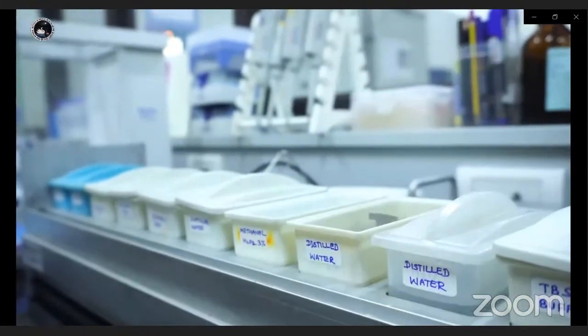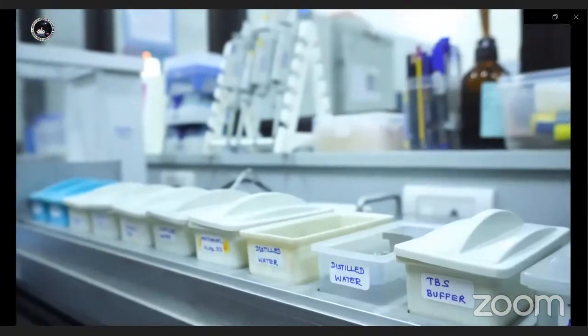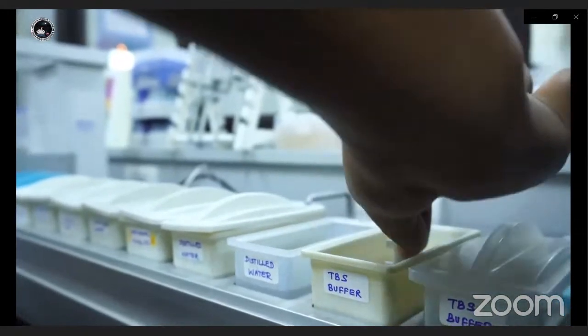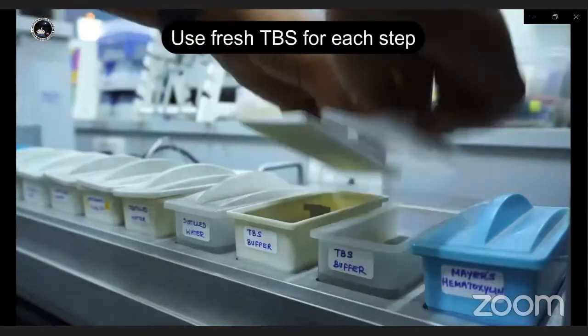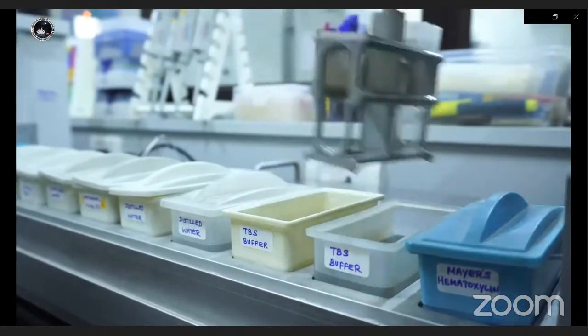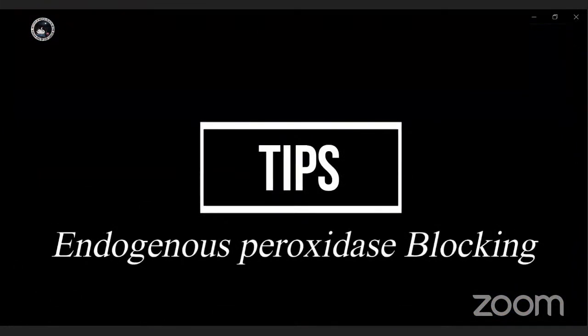Wash the slides in distilled water for 5 minutes and in TBS for 5 minutes. Remember to use fresh Tris buffer every time. This step of endogenous peroxidase block is very important. Make sure methanol H2O2 is freshly prepared for each use. If not, it will affect the staining quality and interpretation as all RBCs will be positive.